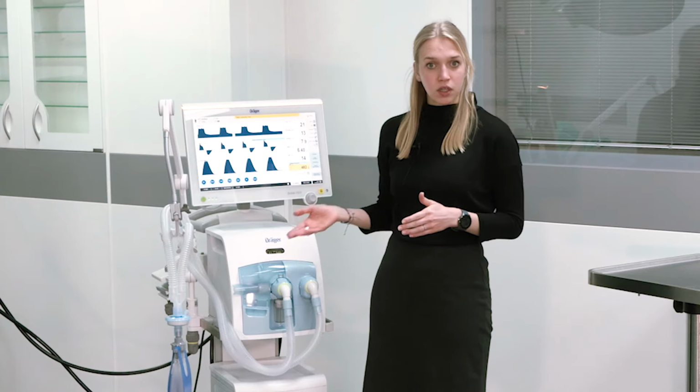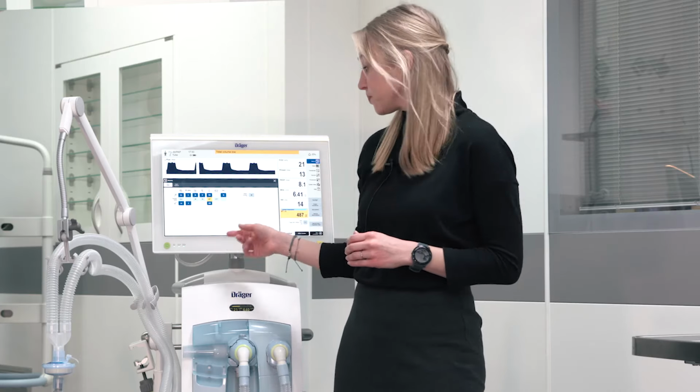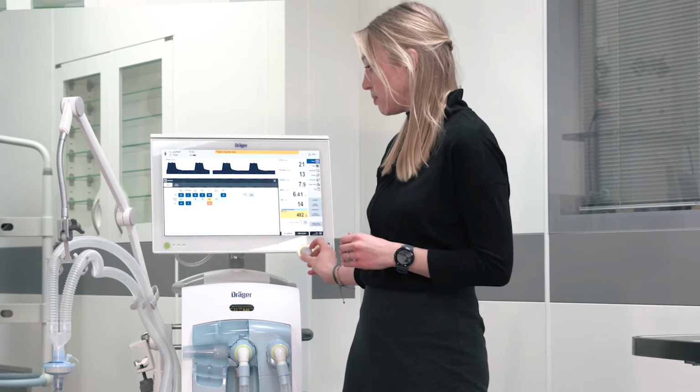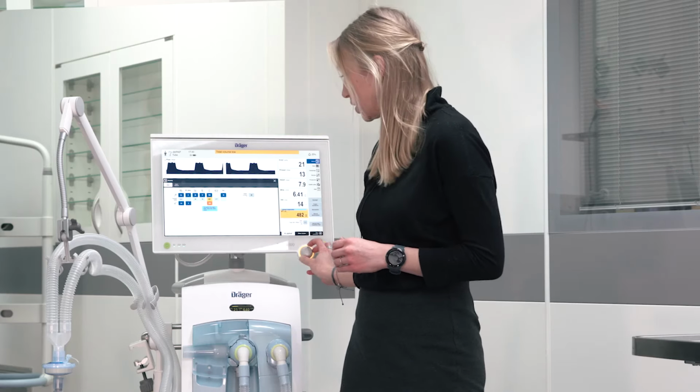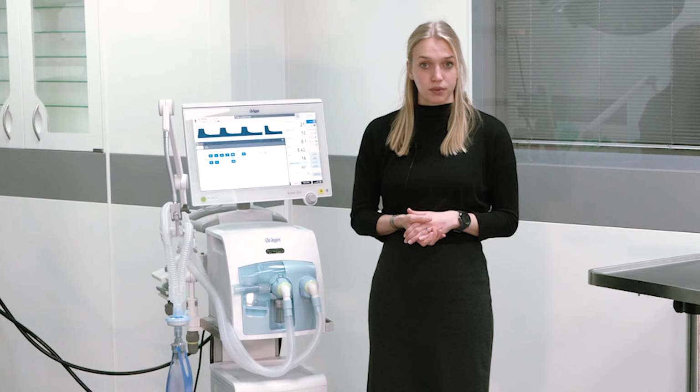If an alarm is present, the ventilator will give you an acoustical and visual signal. Please check the patient condition and the condition of the breathing system. However, it might be necessary to adapt alarm limits during operation. Please press the respective parameter to enter the alarm menu. Select the alarm limit and put it to the desired value. You can confirm by pressing the rotary knob.